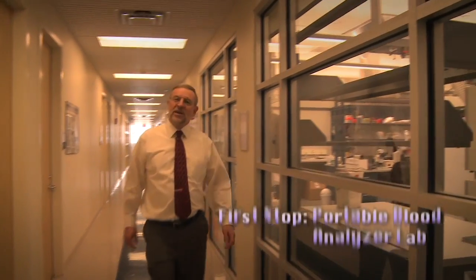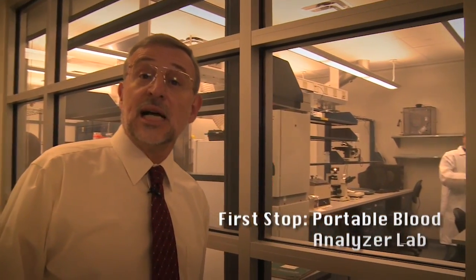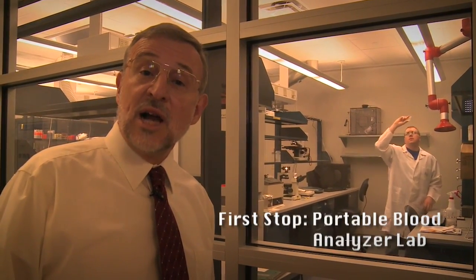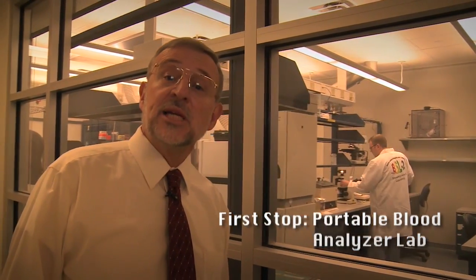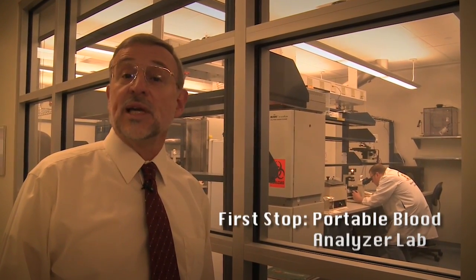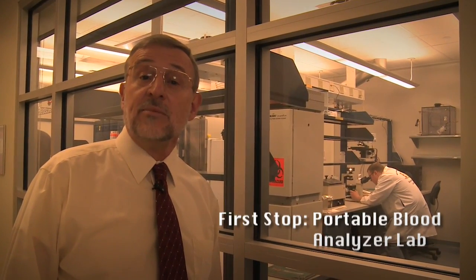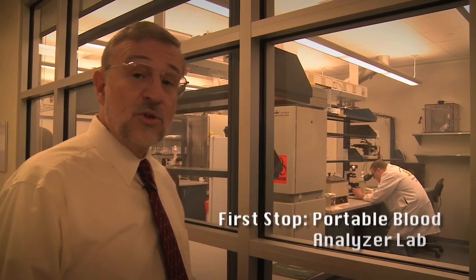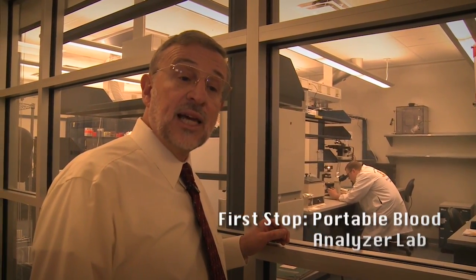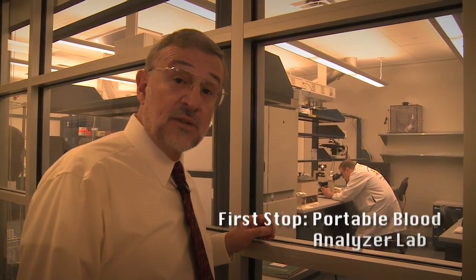Let's stop at my lab here. This is where we're making a portable blood analyzer device that's about the size of a cell phone. We're going to be giving this to astronauts to take up on the space shuttle and space station. And we're also going to bring it into operating rooms when newborn babies are born so we can analyze their blood and try to see if there's any treatment that the babies need immediately after birth. Inside the room, you'll see my student looking at some of the little microchips. Again, these things are about the size of a microscope slide, and they're going to go inside this device.